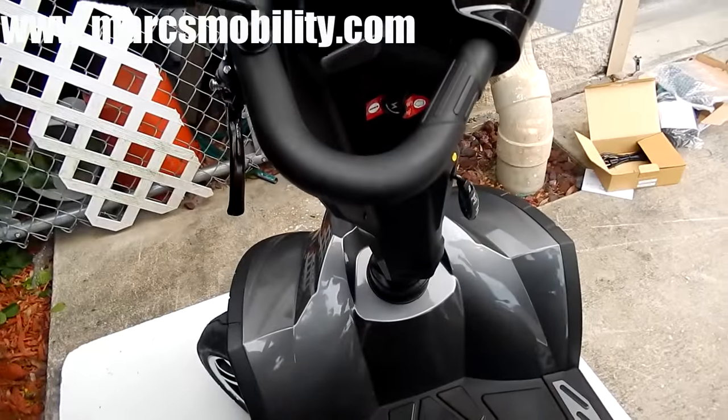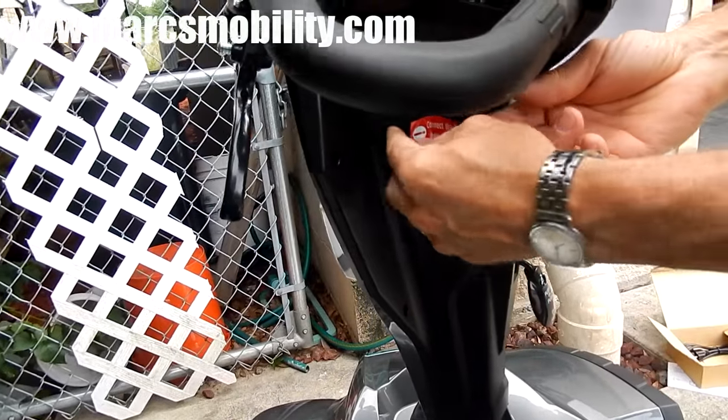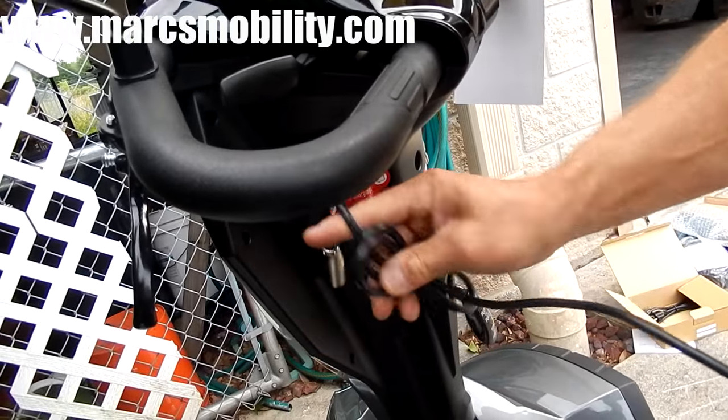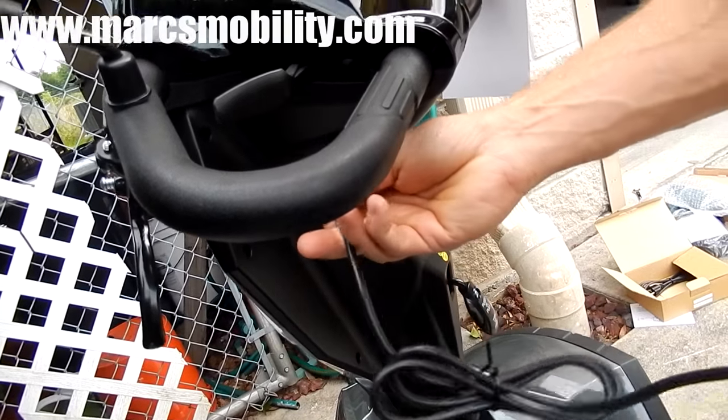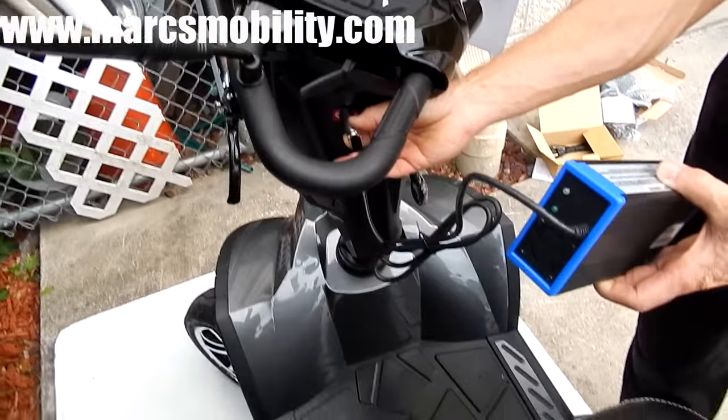For your scooter battery charger, there's a little door right here. This is a brand-new scooter, so we'll take the sticker off. Plug your charger right here into the port, and when your charger light turns green, you're fully charged.